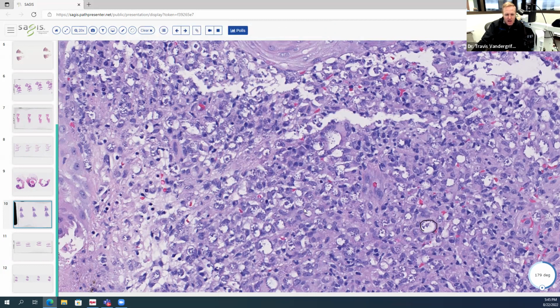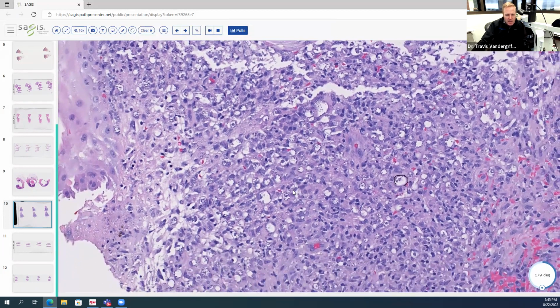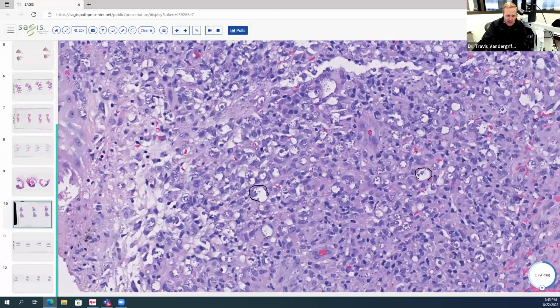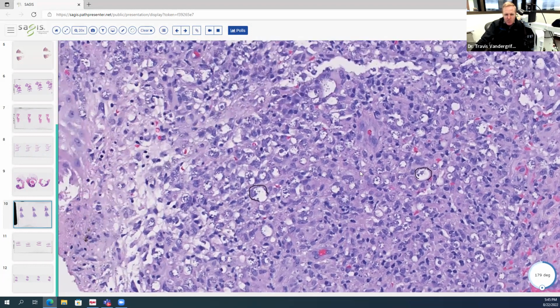That's called the marquee sign or the Ferris wheel sign. It's basically like a configuration at the periphery, like the light bulbs at the movie theater that announce the movies. That's the marquee. And that's the configuration at the peripheral rim of the histiocytes. That's one clue to this being Leish rather than histo.